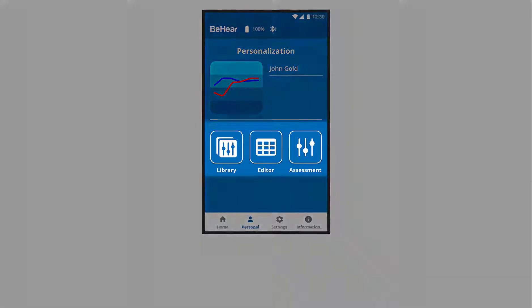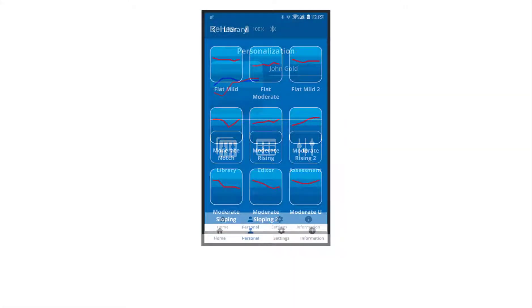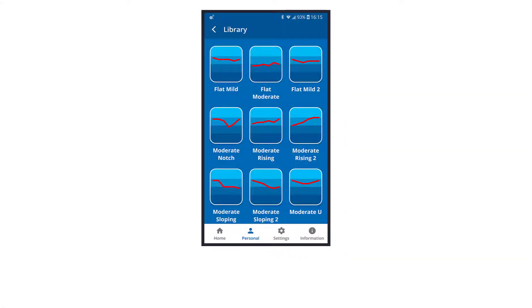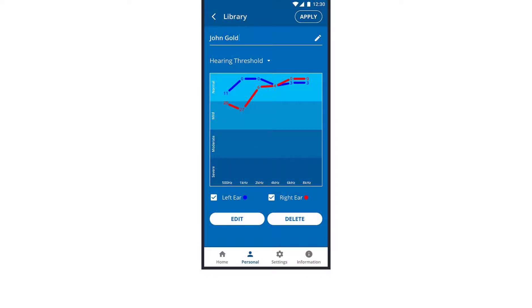The icons lead you to different personalization options. In the library, you can choose a sample hearing profile based on common hearing loss types. This option is helpful if you've already had a professional hearing test and can compare your results to our suggestions. After choosing a sample profile, you can edit it.